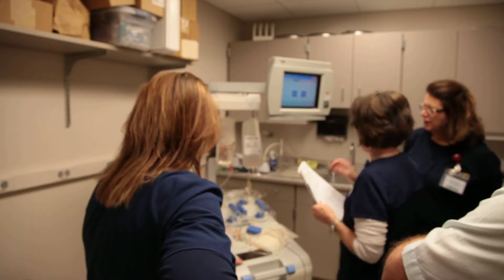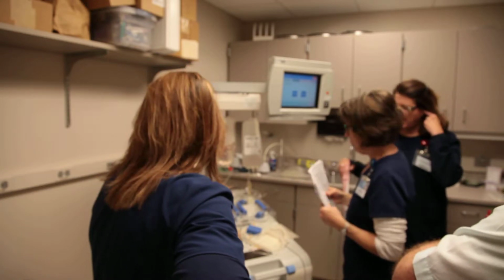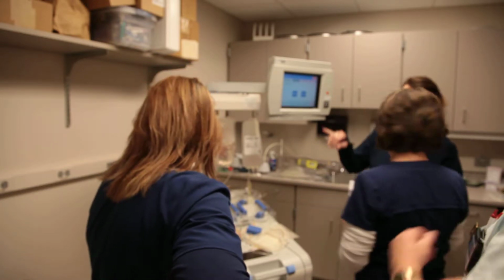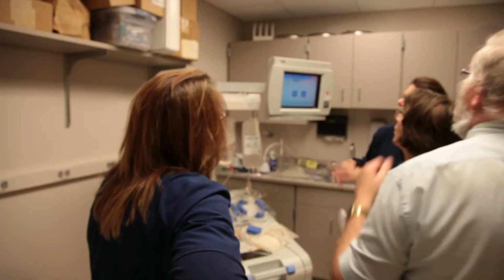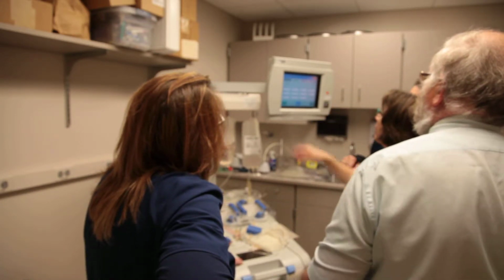Okay, then you would push this and you would get it all primed to the end. And actually, ours are already primed to the end, but we can just go back and push it. Go to the second screen.